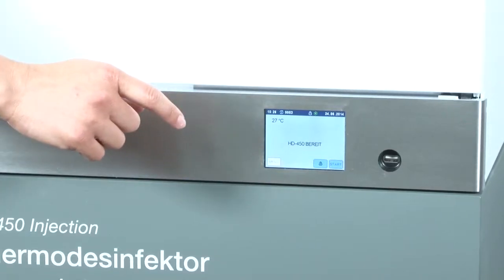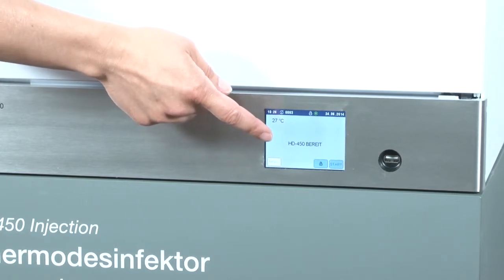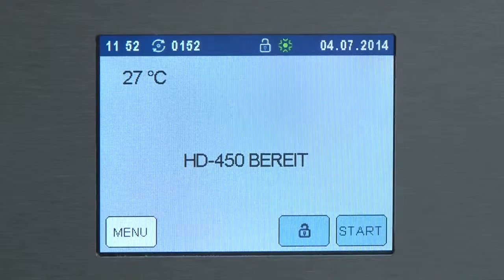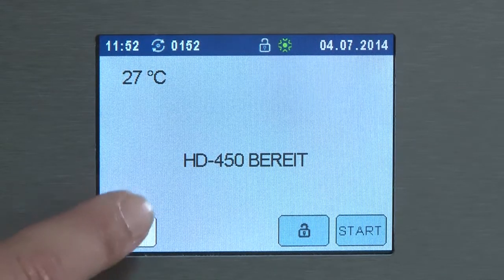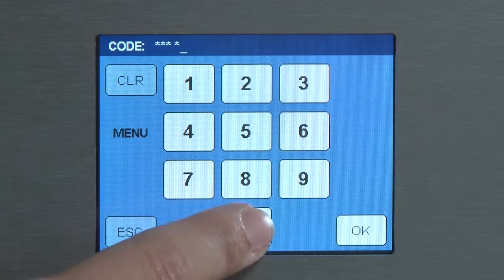Administrator menu. On the right side of the bezel, the IC Medical touch control is allowing them to select all parameters. They have the following options: pressing the menu button, and then entering the administrator code. This leads to the administrator menu.